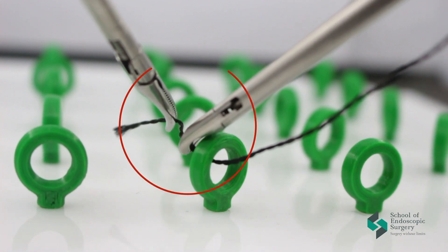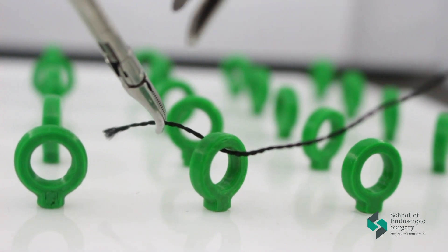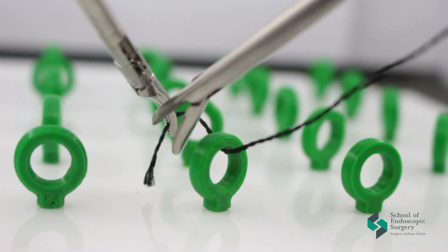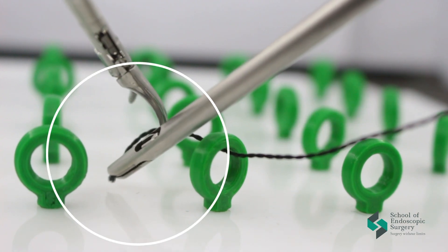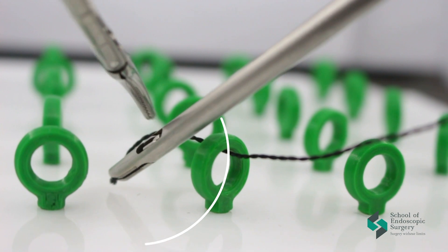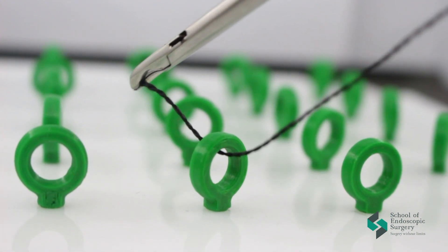Let's start with the mistakes. First mistake is not grabbing the thread by the tip. We need to grab the thread at the tip with our lead tool, in this case the needle holder. And the second thing to remember, we need a large stock of thread at the outport, because this will help us when we start forming the loop.